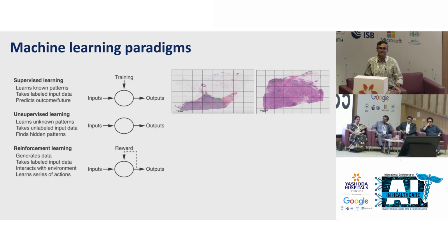There are different jargons you could come across in the machine learning paradigms, from supervised to unsupervised to reinforcement learning. But none of these are being used in our context, because the information that we have with the slide is not sufficient to build a full supervised learning framework, where you have the labels of the data and use those labels to build the model as input-output information.